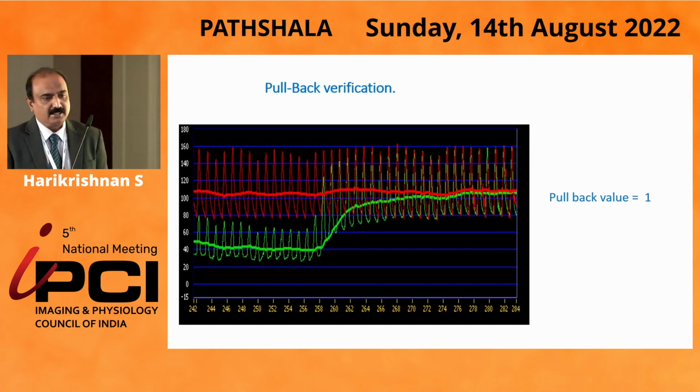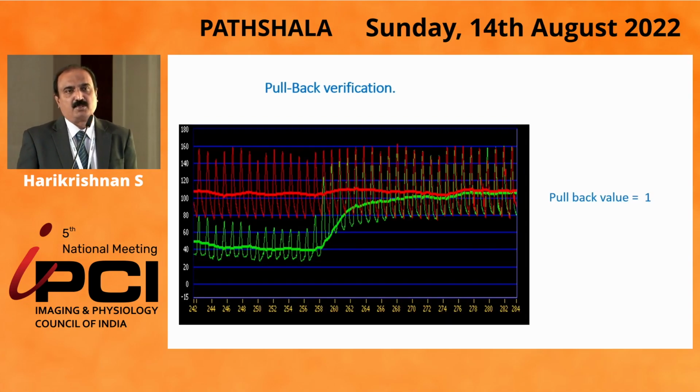Pullback verification, I think it was demonstrated. I think it is the most important step when you are doing a physiological measurement. Always do it. Otherwise, if you are not doing it, you are doing an injustice to the patient. Always make sure that you do a pullback at the end.